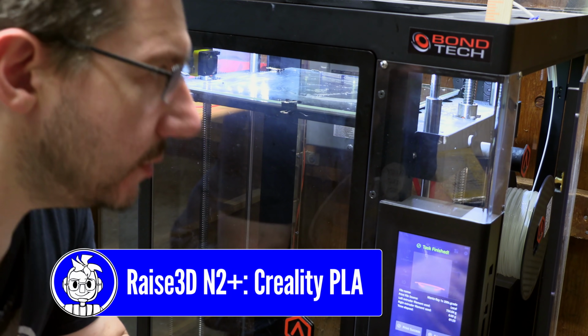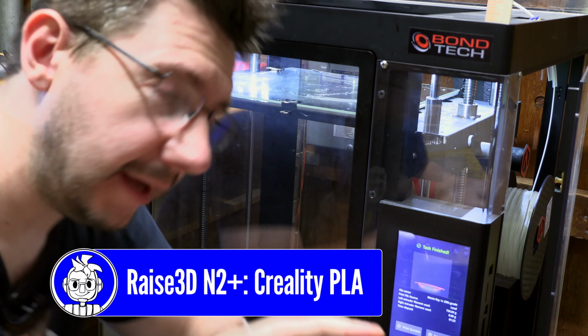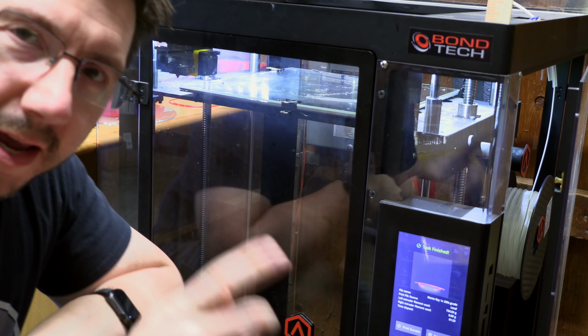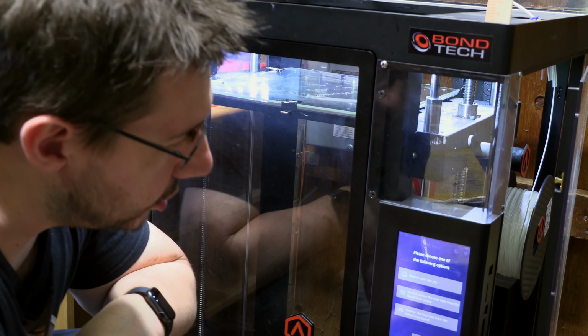We're at the Raise3D N2 Plus. And you know, in the past I've had leveling issues with this thing, but we're just doing PLA. Should be pretty easy. And because I have jobs set up on this, all I have to do is poke a button that says, was the last print successful? It sure was.